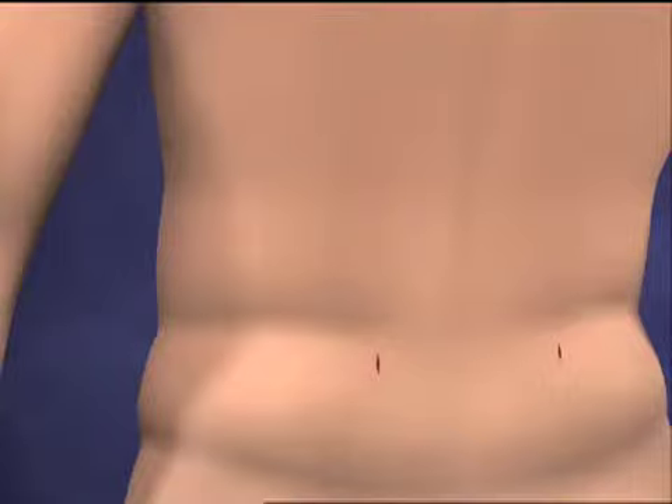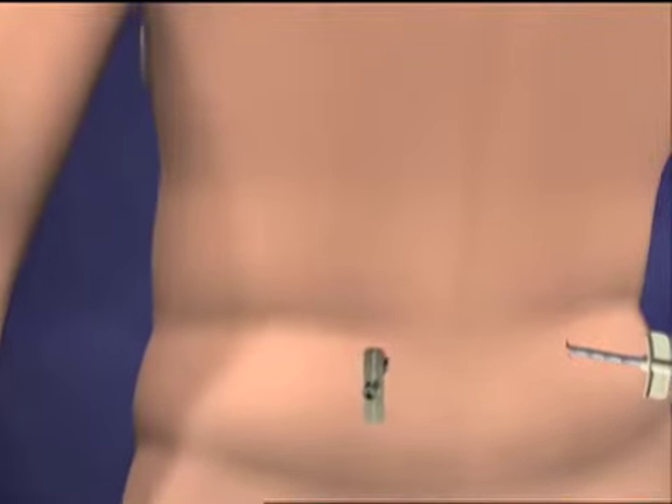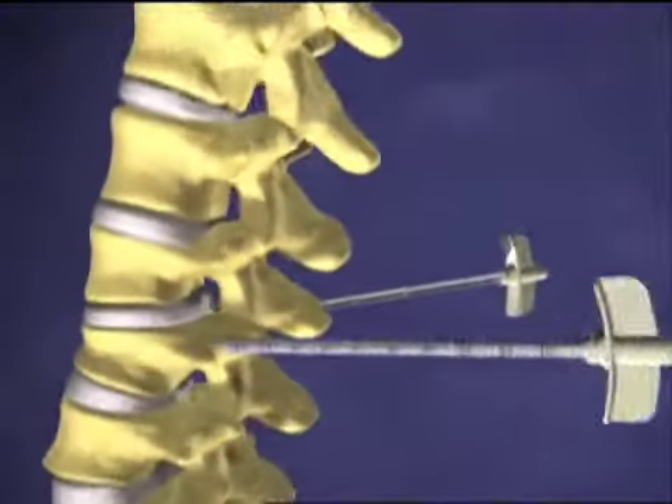Under real-time x-ray of the spine, viewed on a video monitor, a trained spine specialist creates narrow pathways in the back on both sides of the fractured vertebra, using a hollow tube-like instrument about the size of a pencil.